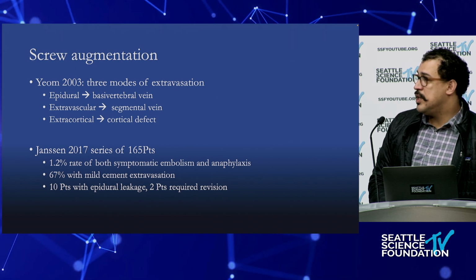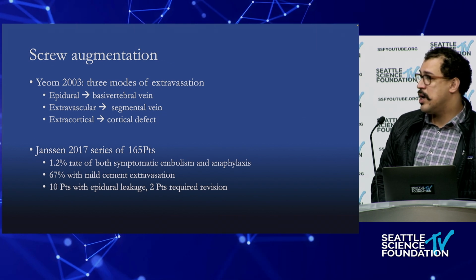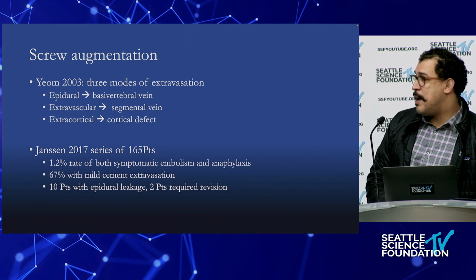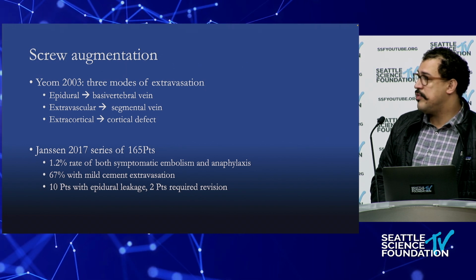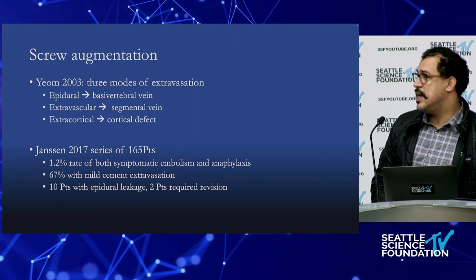And we looked at that 67% with some extravasation. It's almost, I would say, maybe even higher, where you'll see a small piece of cement coming out. The vast majority are not symptomatic, but epidural leakage, again, 10 patients, 2 enough to where they thought that they required revision and went back in to remove that cement, which is an extremely challenging case to have to do.